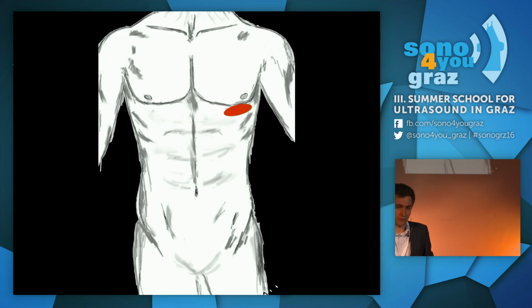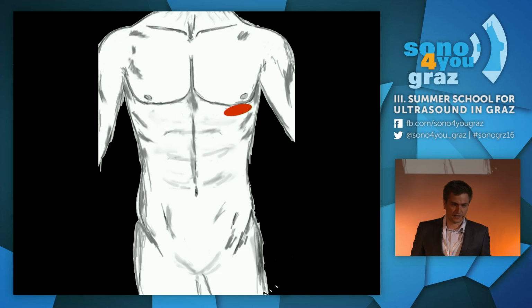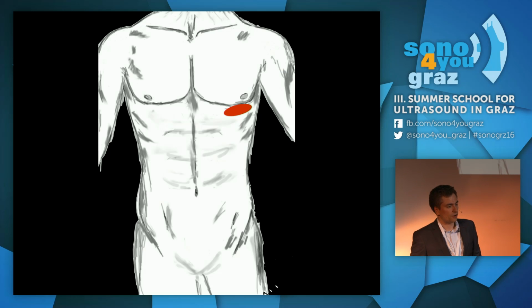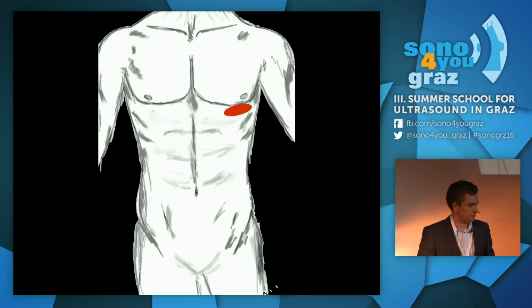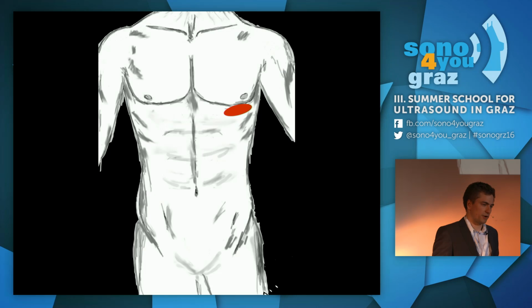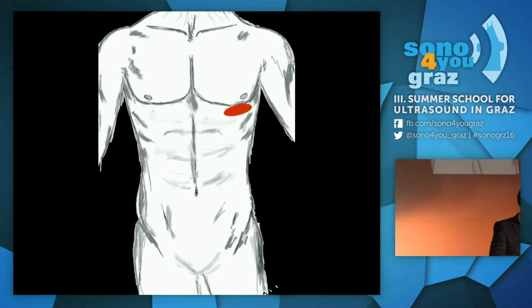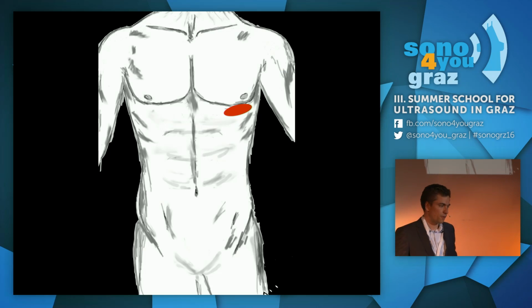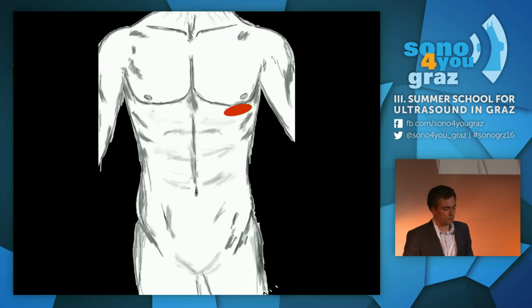Let's face another scenario. You want to do a cardiac exam. You're feeling for the apex, and you want to put your probe exactly there and have a look at the heart. But you have a little problem. You can't take the linear probe, because you have the ribs, and you have to go through the ribs into the depths, because you can't ultrasound through bones. This is really not the conductivity that ultrasound machines are made for.